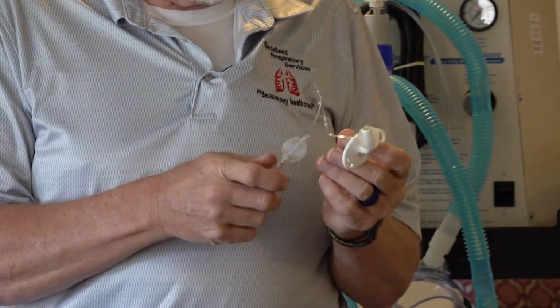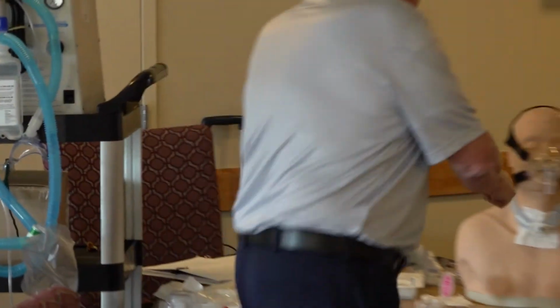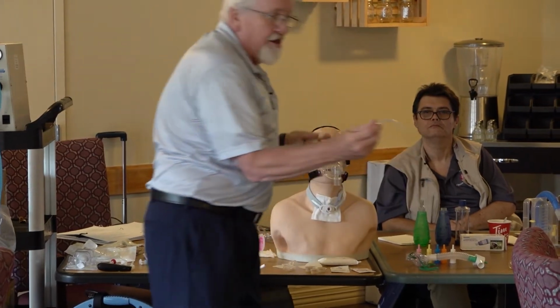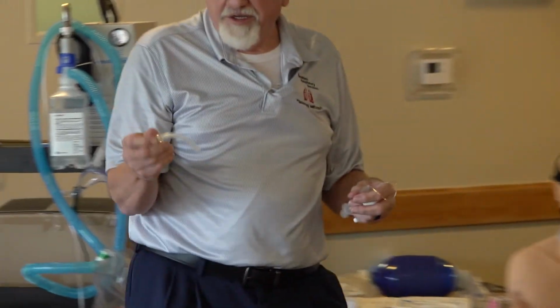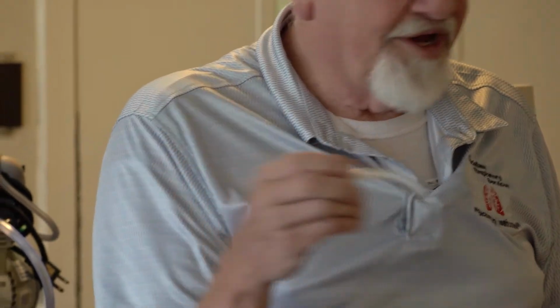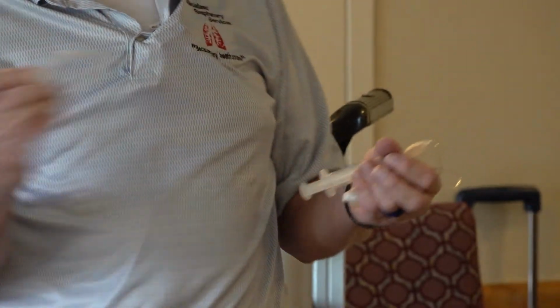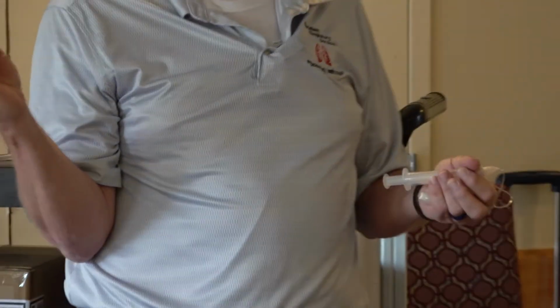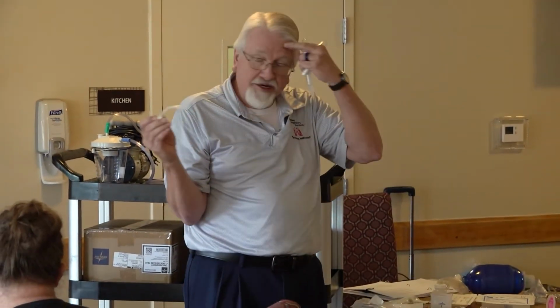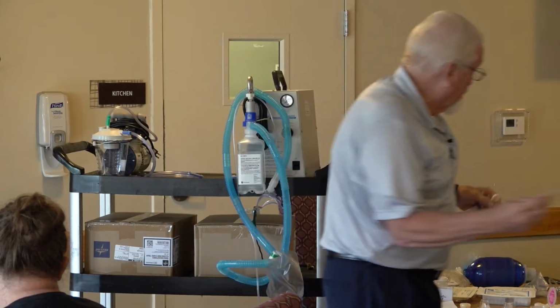Okay, and then the other would be a trach like Bob has in here, which is a twist and lock, where the inner cannula, you twist it, unlock it, and you remove it. These are not disposable. These you have to clean, so don't throw them away. If you have to twist to get that out, don't throw it away. You're going to use your Trach Care kit, and you're going to clean that.